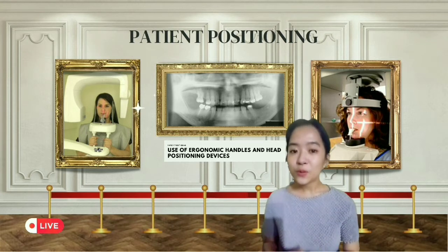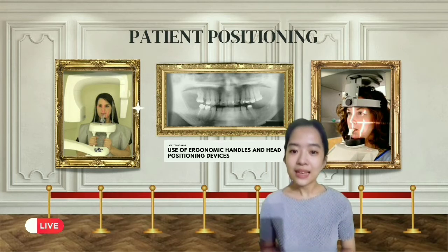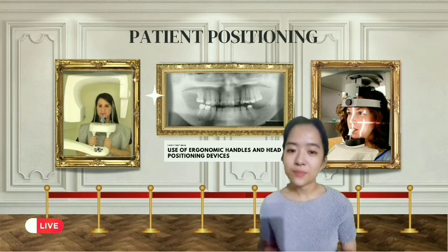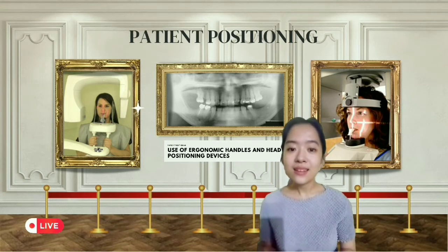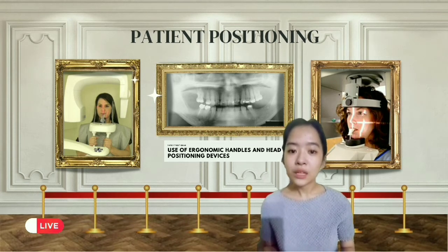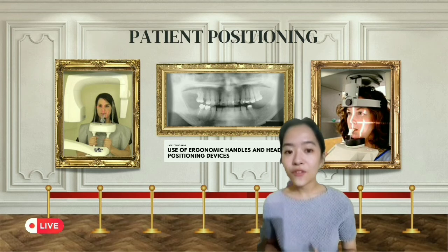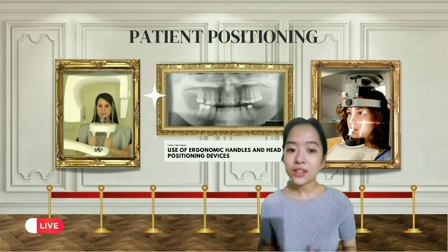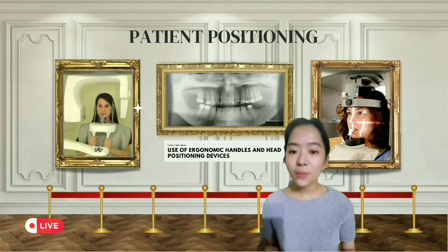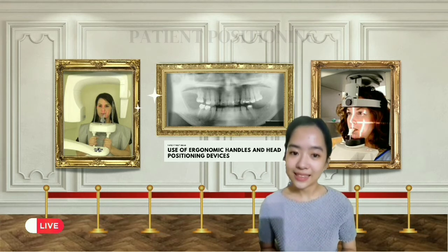To your left, we see the laser alignment lights used by many panoramic manufacturers to offer guidance with patient positioning. These lighted lines allow the radiographer to easily visualize the mid-sagittal and Frankfurt planes. Some lights also indicate the correct position of the focal trough. Although each manufacturer's positioning and exposure instructions vary slightly from one another, there are some general requirements that are common to all panoramic imaging procedures, whether digital or film-based.